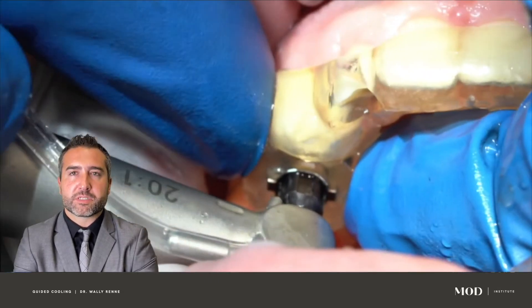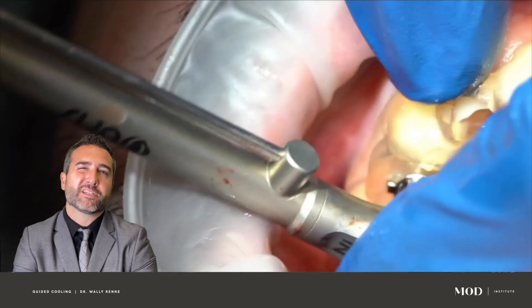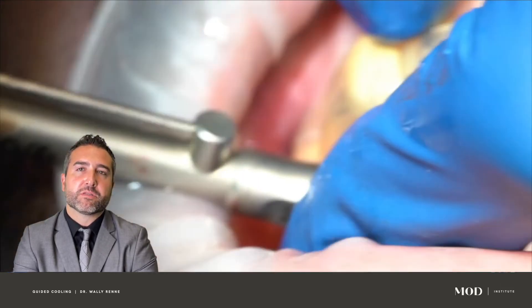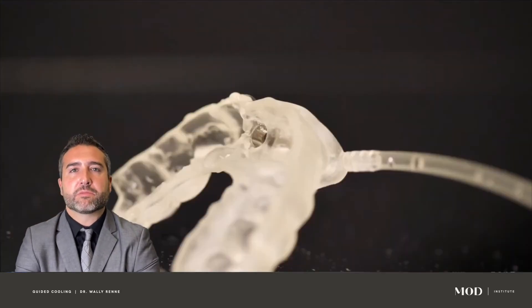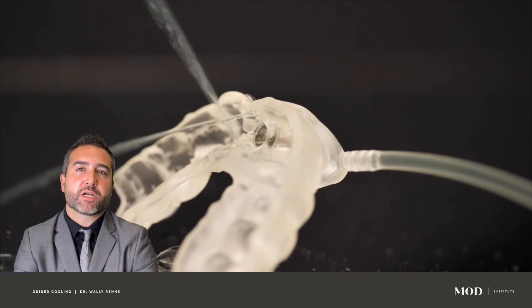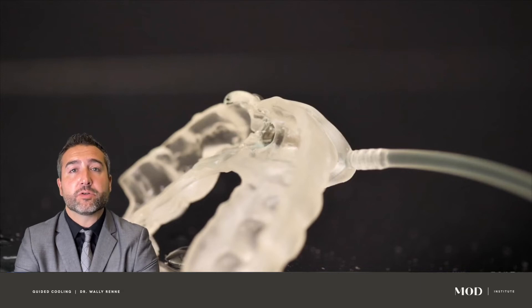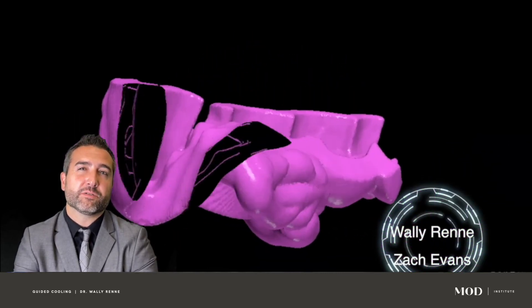Here's what we're going to do to solve this notorious problem that has gone unaddressed on the podium and at many courses: the problem of increasing heat during osteotomy preparation when using a surgical guide versus no surgical guide. Because we're able to 3D print intricate details — unlike milling — we're going to create ports where you hook up the irrigation tube to the surgical guide through a 3D-printed port. Internal channels will inject coolant down into the osteotomy site, helping to flush and decrease temperature. I've been doing these custom irrigation channels for about five years now.